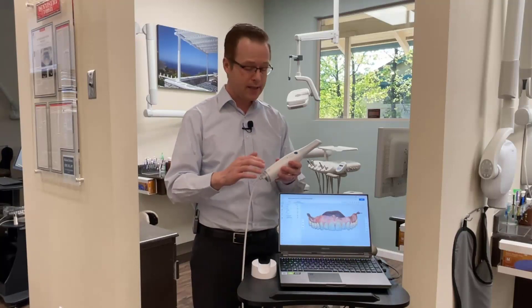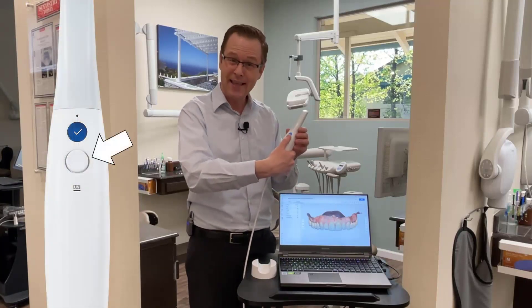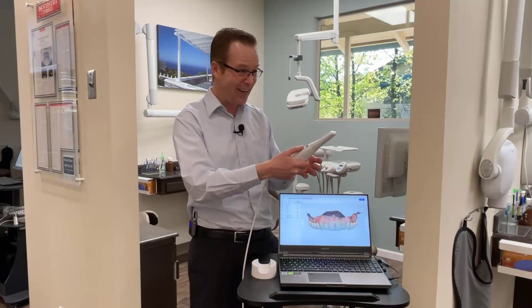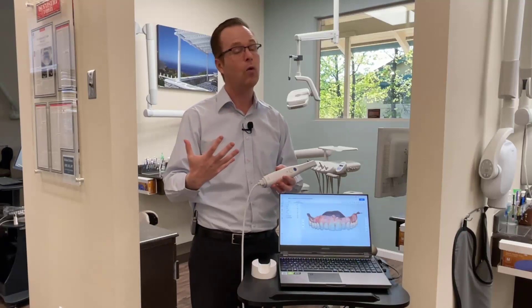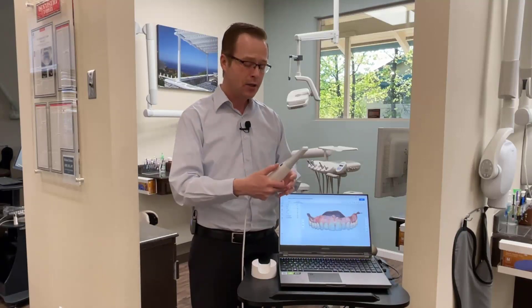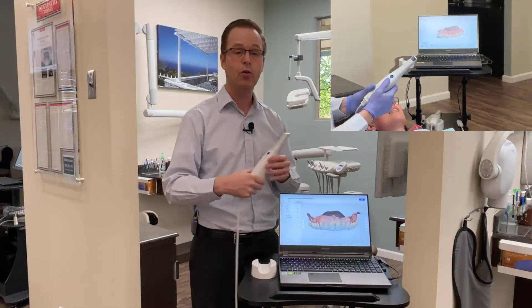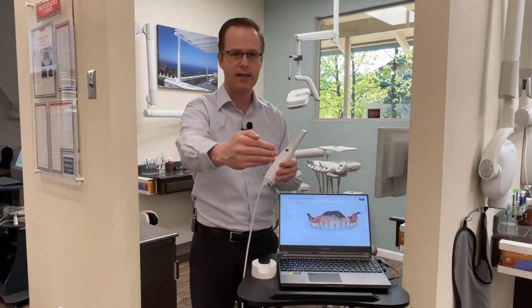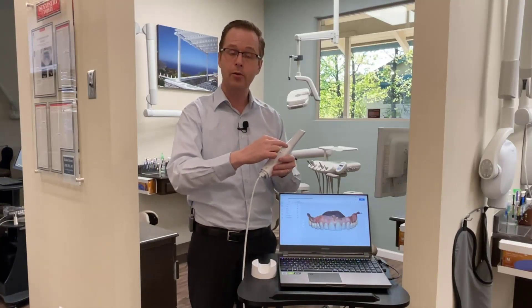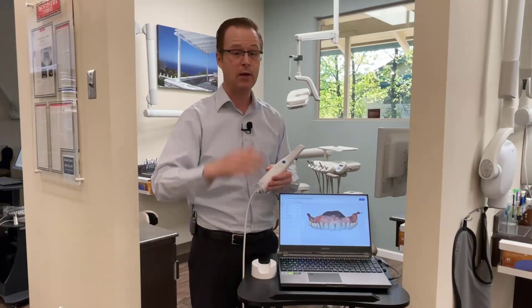Finally, they also have a remote control function — I called it a joystick because it kind of looks like one of those Nintendo 64 controllers. It allows for touch-free or touchless operation. When I scan, I can move the scan around, zoom, pan, and tilt. Additionally, a long hold on the check button will allow you to advance to the next phase of scanning — start with the upper, long hold the blue button, and you can select to go to the mandible, then the first bite, then the second bite. I thought that was pretty cool.